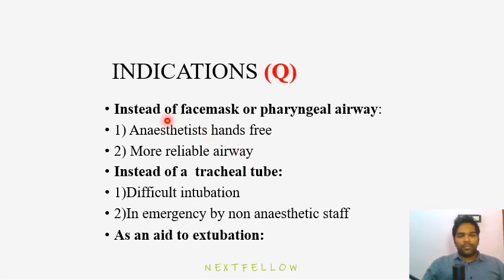Now indications. Instead of a face mask and pharyngeal airway: normally in face mask ventilation, we have to hold the face mask with one hand and squeeze the bag with the other hand. In the video itself, you saw he held the face mask and was pressing the bag, so both his hands were occupied. That can be avoided. The anesthetist's hands are free, and whenever hands are free, we can do many things. We can write the case sheet, put a central line, do blocks, or do multiple things. So our hands will be free, and it is a more reliable airway.